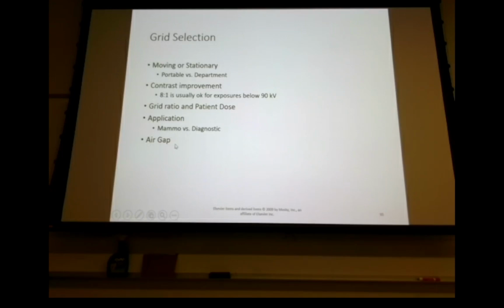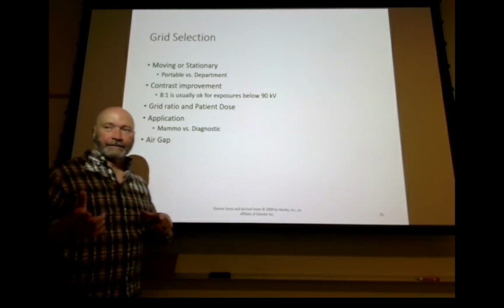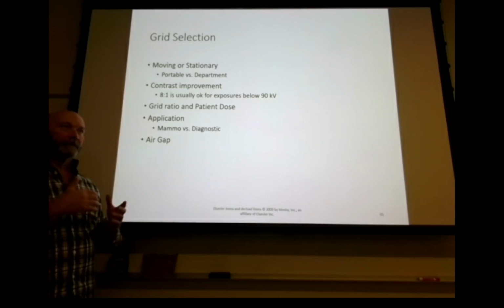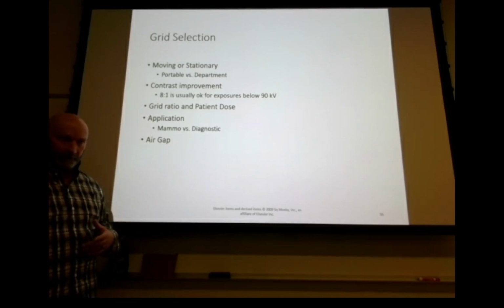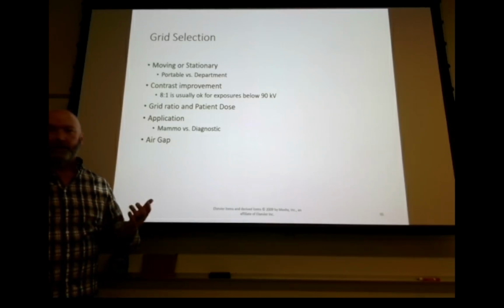So, air gap is worth mentioning. Air gap is probably not as dramatic as what we make it out to be. With the air gap, the science behind it is good, but I think that the contrast improvement factor we might see because of air gap is, even with screens and films, just not all that impressive.